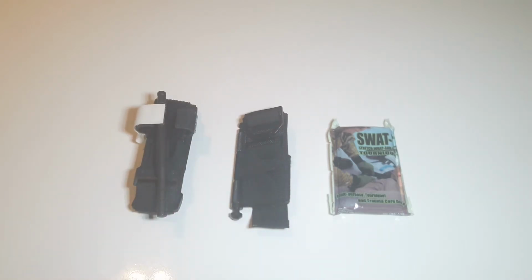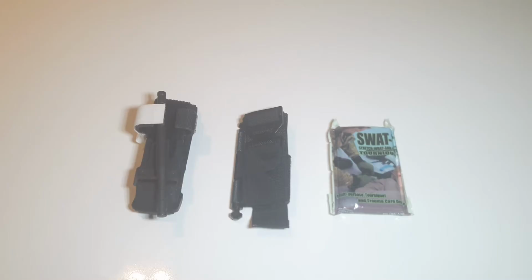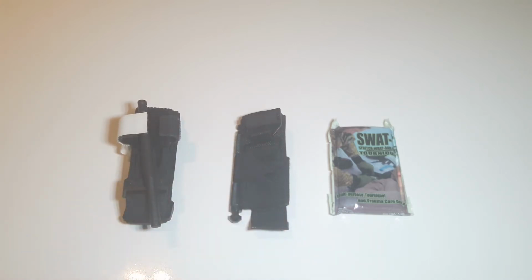They also recommend one other one called the Emergency and Military Tourniquet or EMT by Delphi Medical, but not to be used in the field. It sort of looks like a blood pressure cuff, and they don't specify why it shouldn't be used in the field except that it is far more expensive than the other 2 at around $475, compared to about $33 for these 2. I would speculate that in addition to the higher price tag, the components are more vulnerable to damage, rendering it useless, whereas these 2 can probably sustain more damage and still function.